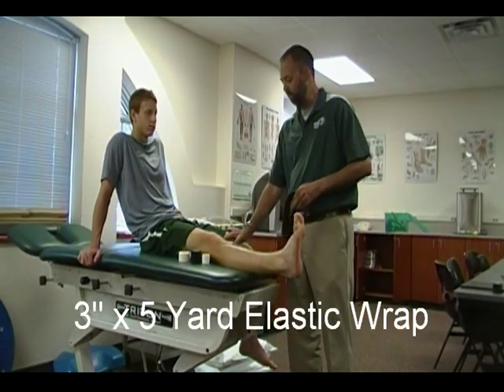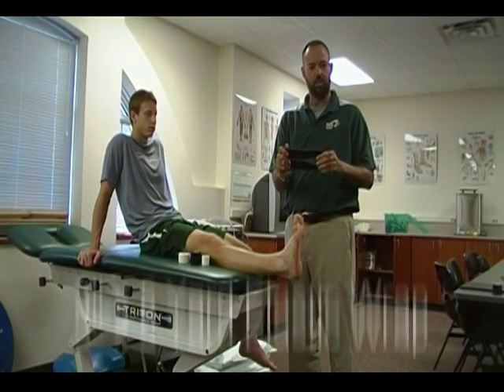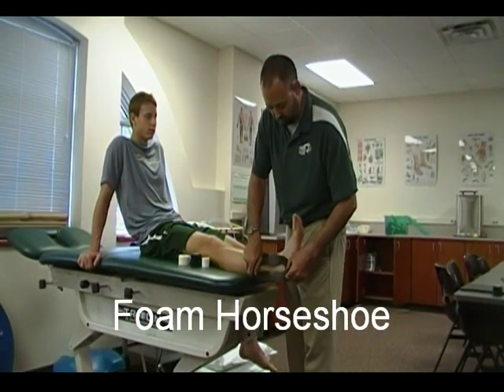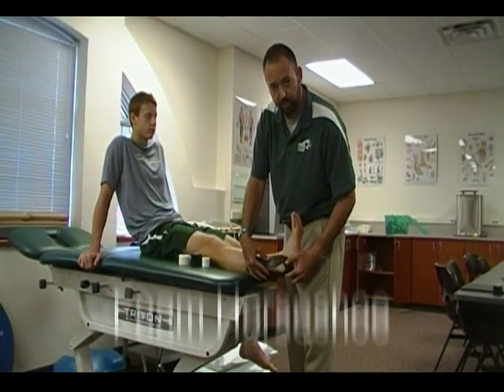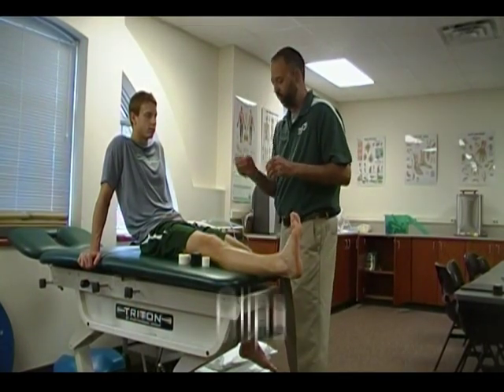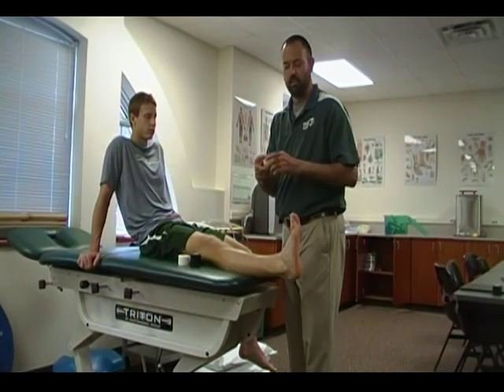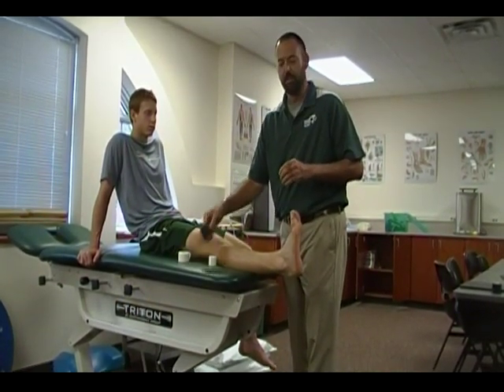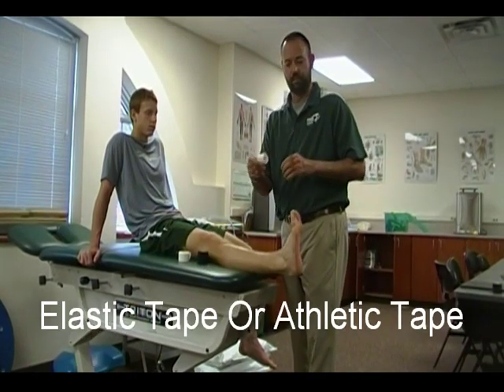I've got a three-inch elastic wrap. I've got a closed-cell foam which has been cut in the shape of a horseshoe. It's placed over the malleolus at the base of the foot. And then I've also got the clips that come with the elastic wrap. I can use that in the acute setting, or if I'm going to place it on the athlete for a longer period of time, I can use my elastic wrap, elastic tape, or athletic tape.